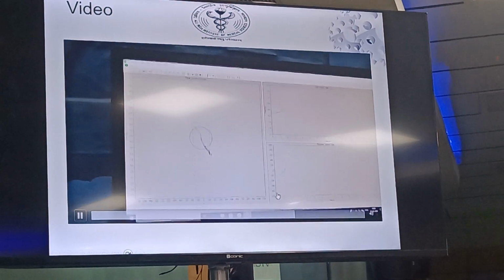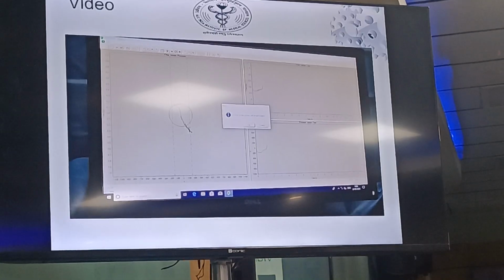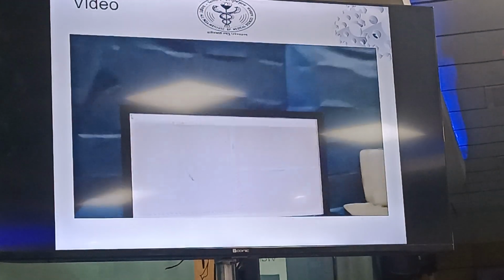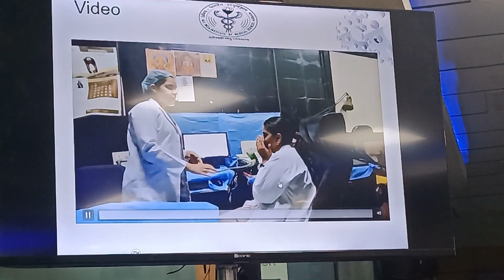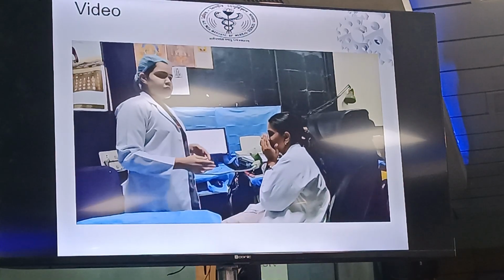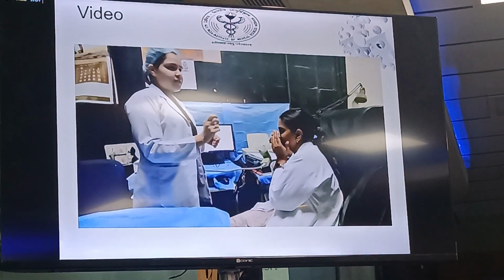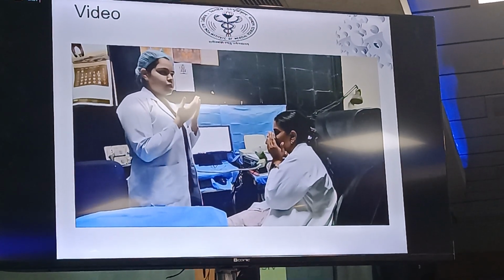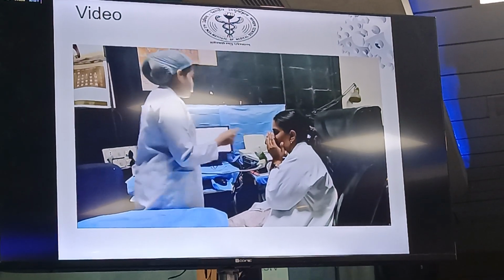Once again the patient starts, machine starts. Now once you are done with the left side, we repeat the same procedure onto the right side of the patient. Similarly, the left nasal cavity is occluded using the nasal probe and the mask is made to fit onto the patient's face in a sealed manner, and then the recordings are obtained.